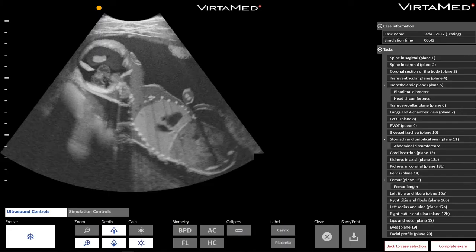I mean, you have two types of ultrasounds. The one are the real ultrasound volumes from real life patients, which are critical for a new trainer to see, particularly when they're less common. On the other hand, you have the truly simulated and developed ultrasounds of second and third trimester fetuses. And to teach fetal anomalies for individuals who are going to be doing these ultrasounds is really, really critical.